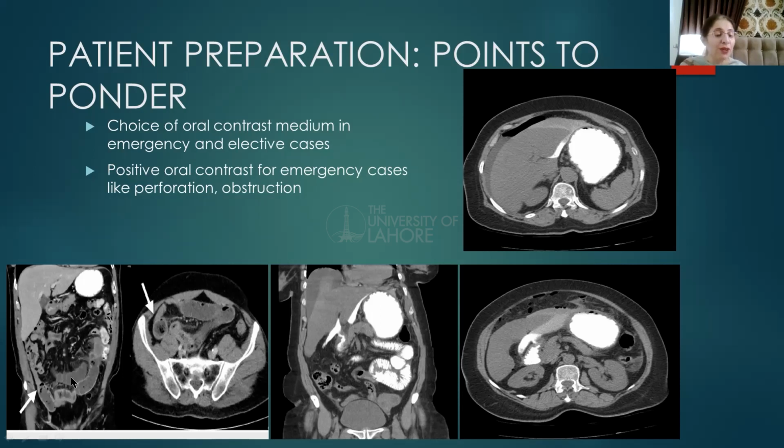Like in this case, if you can see, these are the dilated gut loops, which are dilated proximally, and then we see this narrowed, strictured small segment, and distal to that segment we see the collapsed small and large gut loops. So, emphasizing the point of transition, which is this strictured narrowed segment of the small gut loop, which the surgeon would like to know.